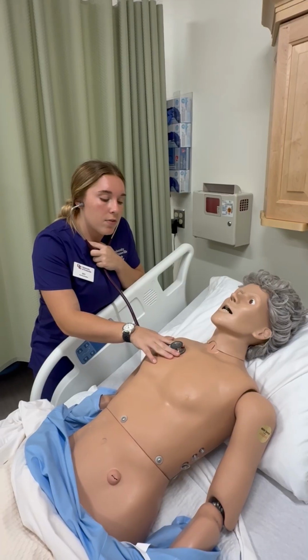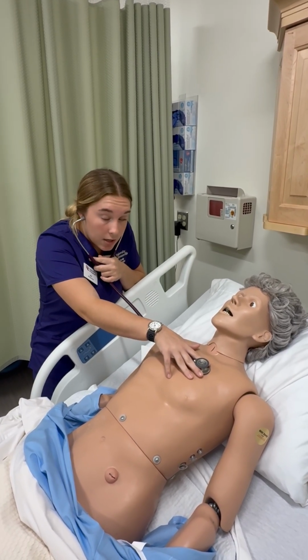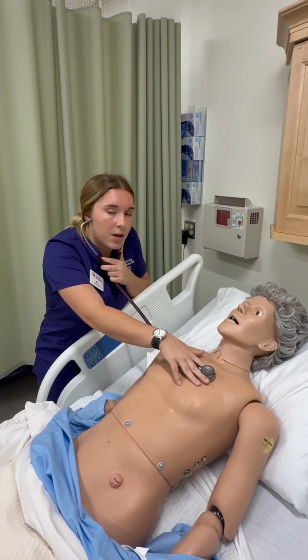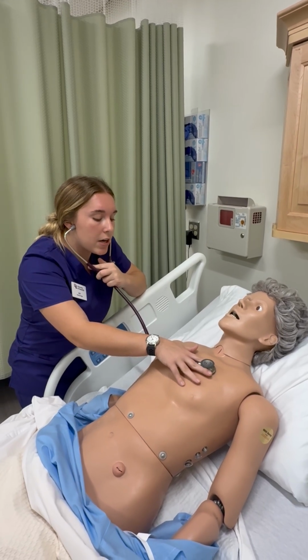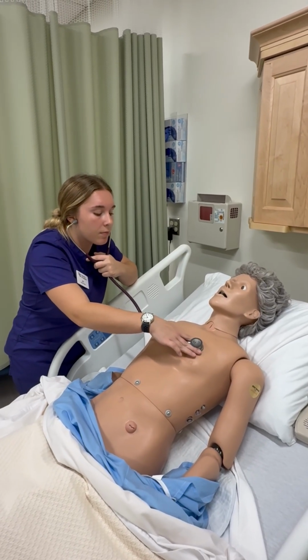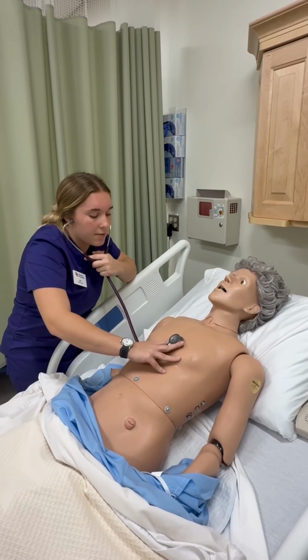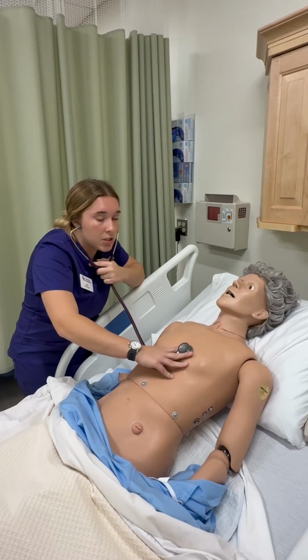From here, I would move over to the second intercostal space, left sternal border, and I will be listening to the pulmonic area. From here, I'll move down to the third intercostal space, listening to the second pulmonic area, which is Erb's point. From here, I'll move to the fourth intercostal space, and if I had to move the breast out of the way, I would, still at the left sternal border. And here I'm listening to the tricuspid area.